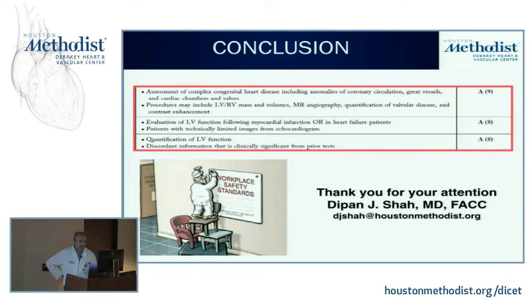And so obviously in patients with congenital heart disease where you want accurate assessment of LV and especially RV function, and we'll talk about the RV later on in the year because that's a whole separate discussion in and of itself. Also in patients post-MI or with heart failure, especially when there's suboptimal quality echo images.